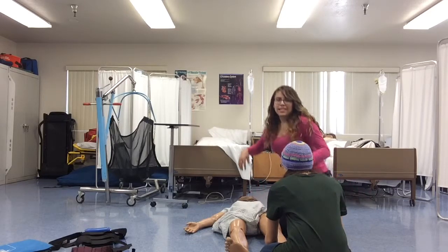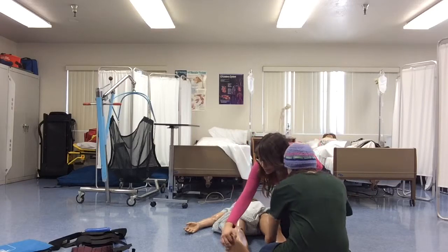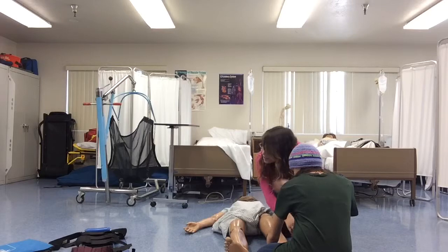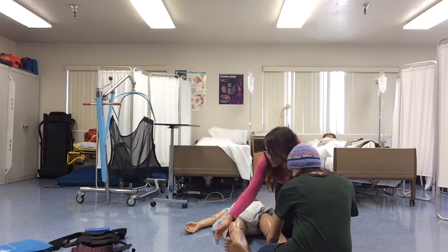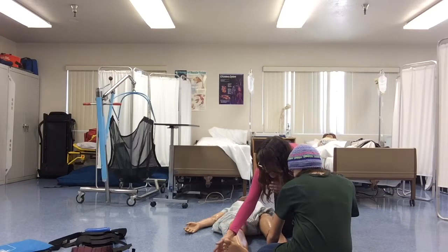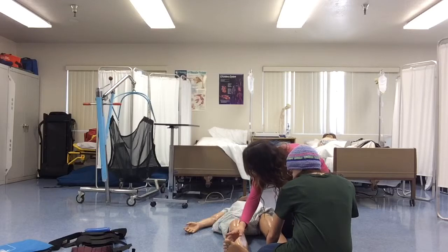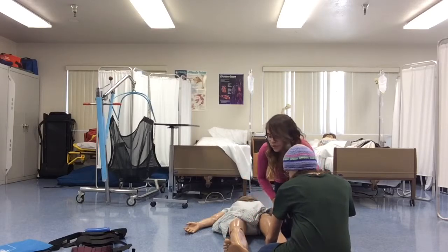Okay. So now I'm going to check PMSS. So push down, push up. Closing your eyes, tell me, am I touching the big toe? Closing your eyes, tell me, am I touching my pinky? I'm going to check for the pulse. Okay, pulse is good. And now can you wiggle your toes? Okay, and she can wiggle her toes.